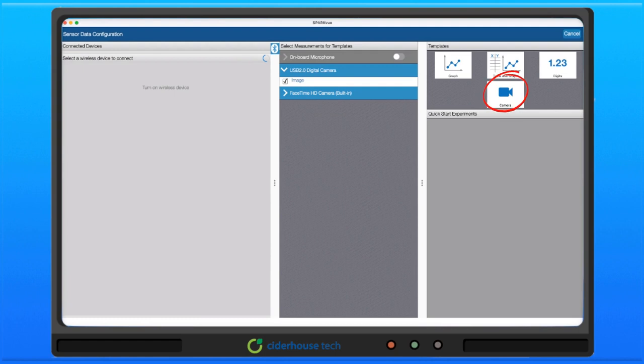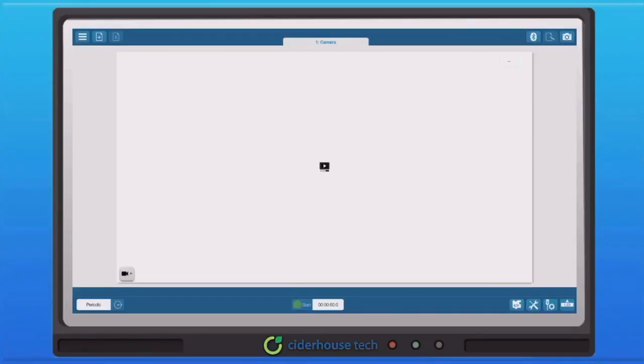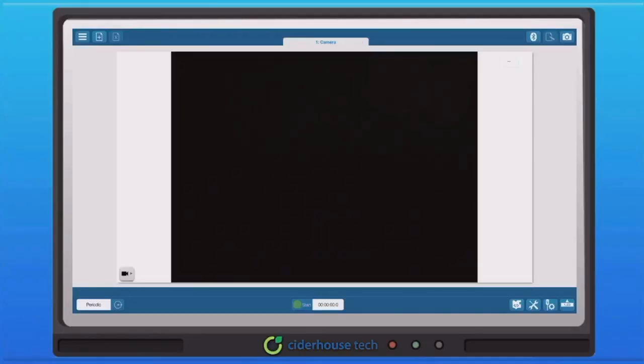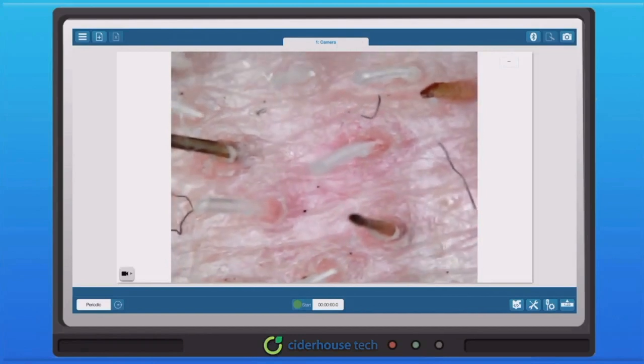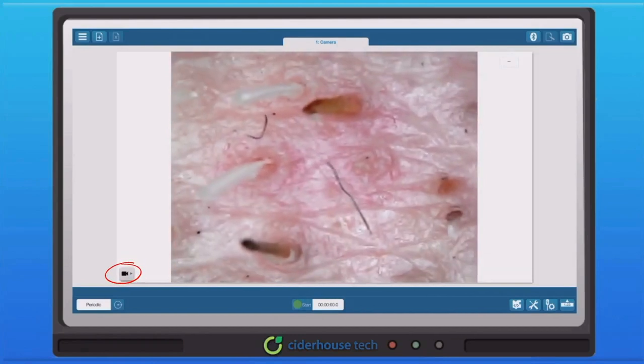You will observe that a new template has appeared in the templates column. Select the camera template. The microscope should automatically initialize. The image will appear on the screen. This example is of a male's face. To open the toolbox, click on the camera icon.